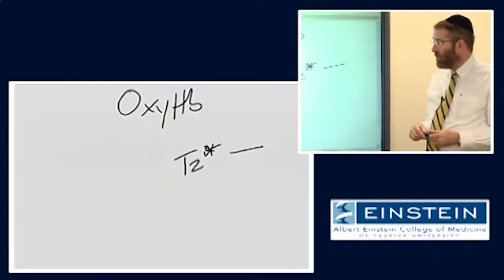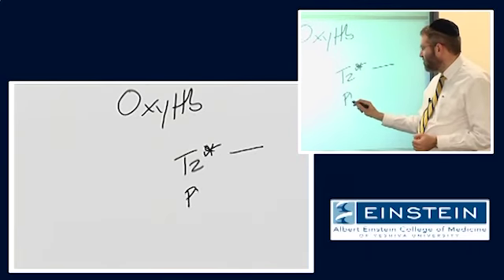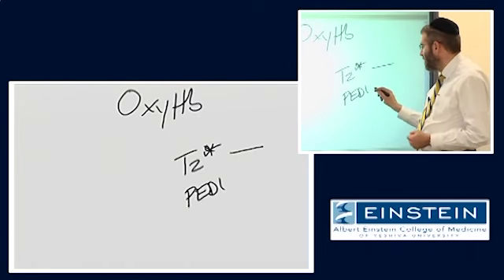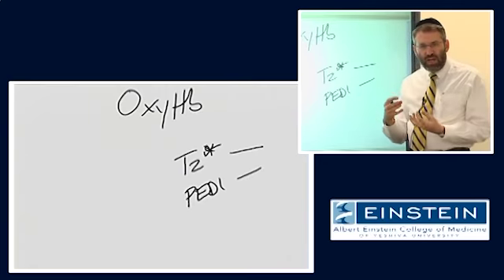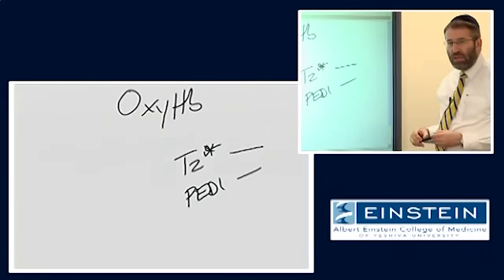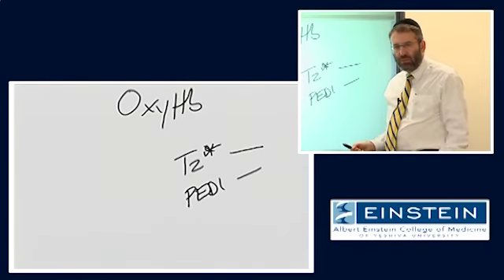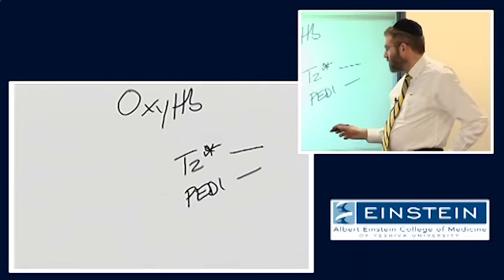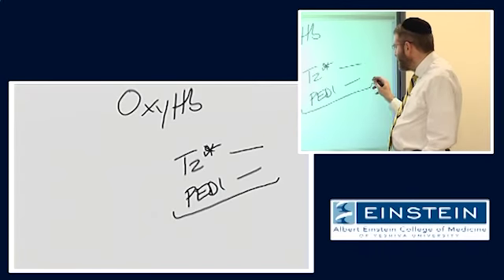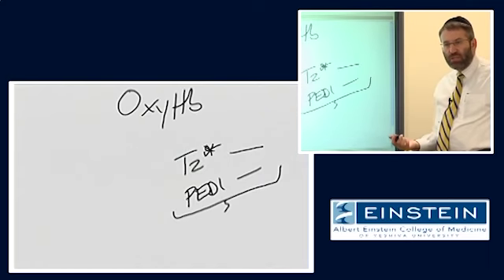There is similarly no proton-electron dipole interaction, because those iron atoms, those iron electrons, are not able to get close enough to a water proton to accelerate its T1 relaxation time. So we would think, based on this, that hemoglobin should be having no impact on the signal of our tissue.